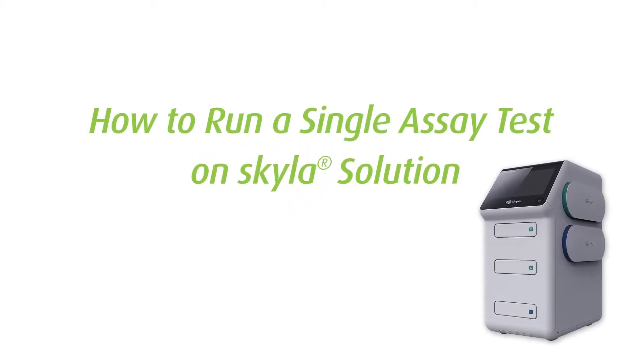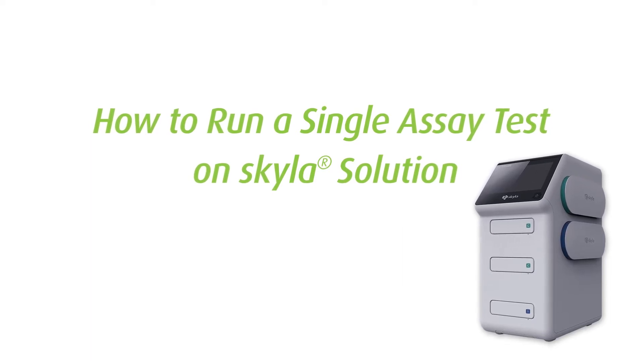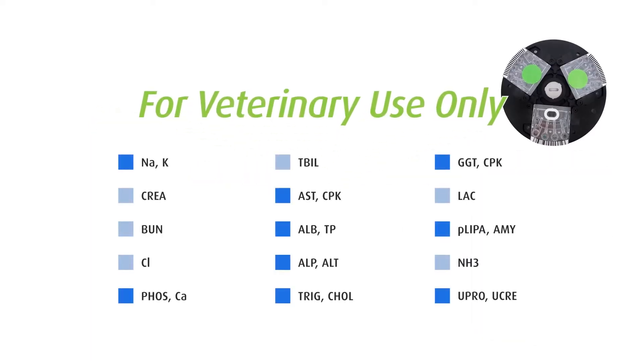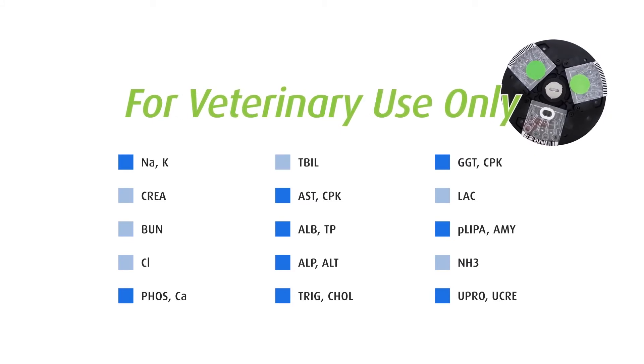This tutorial video shows the instructions on how to run veterinary chemistry test items on Skylaw Solution Analyzer, including the following single assay and duo assay tests.